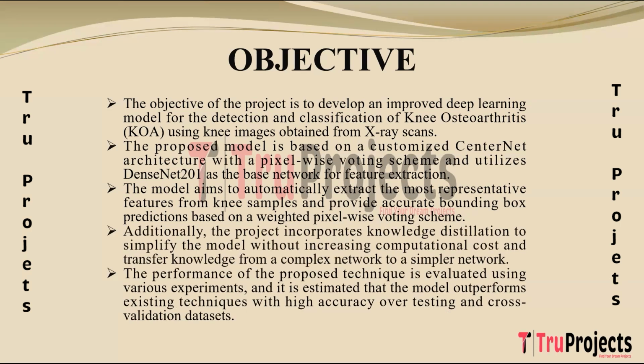It is anticipated that the model will exhibit superior performance, showcasing high accuracy over both testing and cross-validation datasets compared to existing techniques. This estimation is based on the model's ability to accurately detect and classify KOA in knee X-ray images.